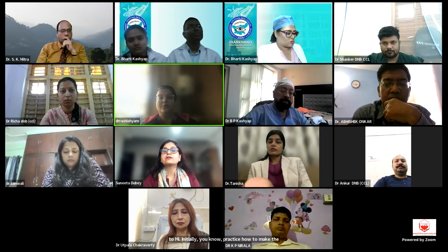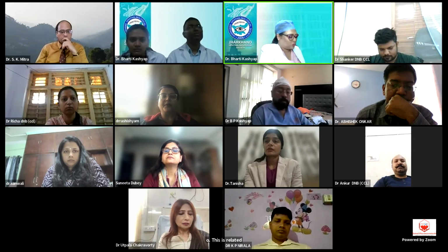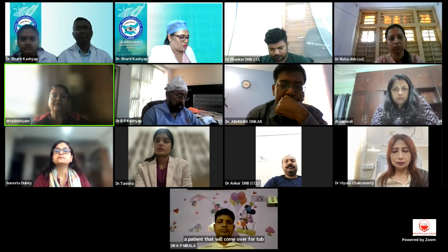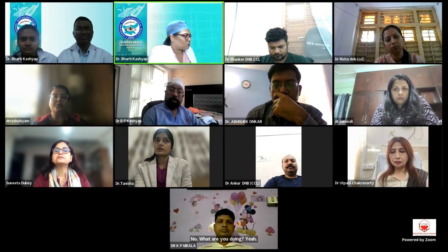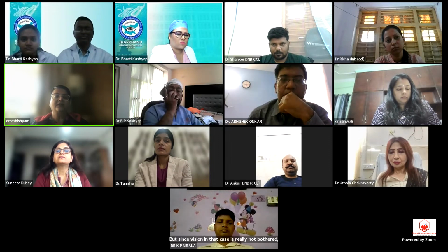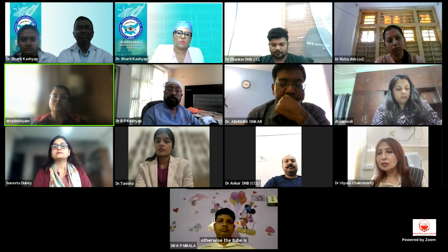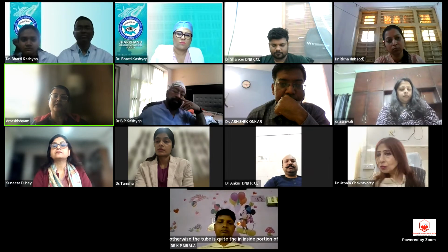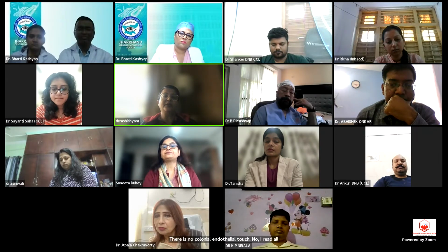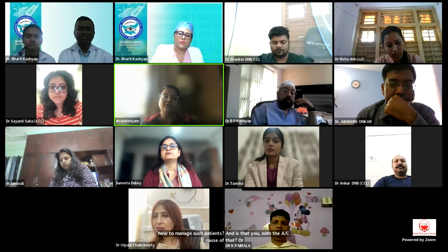Ma'am, I had a question too, related to a post-operative complication. There is a patient that we operated on with a tube implant for traumatic glaucoma. He's an adult. He's having exotropia now, but the vision in that eye is not bothered by it. He keeps having recurrent low-grade uveitis. The eye becomes red and painful. Otherwise, the inside portion of the tube is quite well placed in the AC. There is no corneal endothelial touch, no iridocorneal touch, but still he keeps having flare and cells. How do we manage such patients, and is the tube in the AC the cause of that? Is it touching the iris? No, it is not touching the iris.